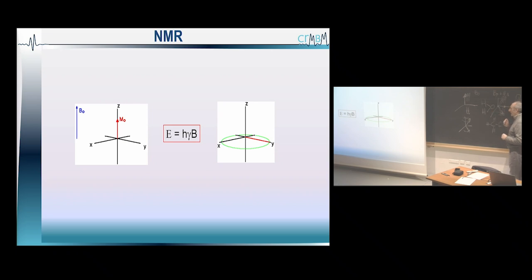Okay? So I'm just telling you that because, in fact, you've got here different spins, and you can imagine that the frequency is different. But if you want to get a magnetization on this axis in here, you not only need to equalize the two populations, but you also need to have a single frequency of precession, not multiple frequencies.